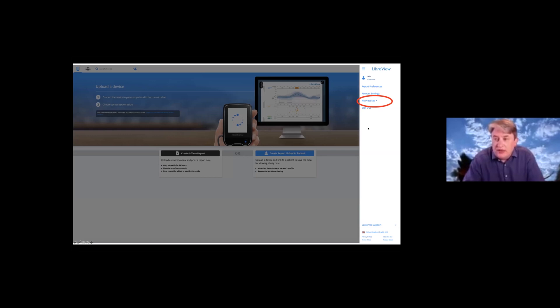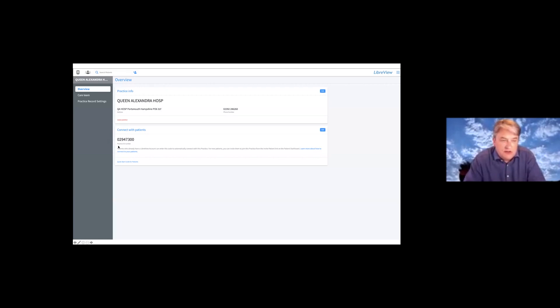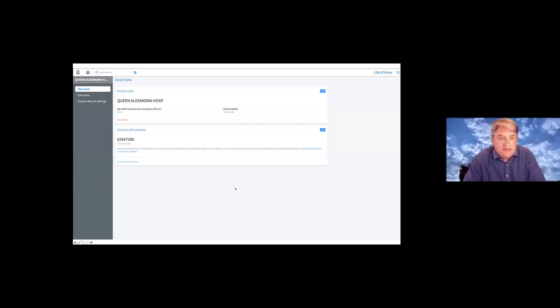The other thing to note — and this is a really important place — is to look into the 'my practice' data on the program, because it shows you your practice number. If you're ever hoping to get patients to share information with you, this number is important. It's a one-off number — in my case it's the number for my own practice at Queen Alexandra Hospital — and this is the number that individuals will need if they're going to share data with you. It's in the program, so it's not something you need to remember off by heart.